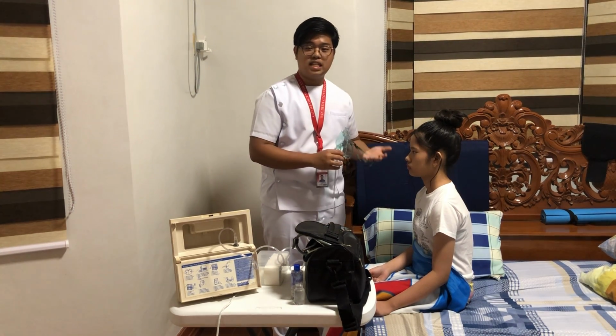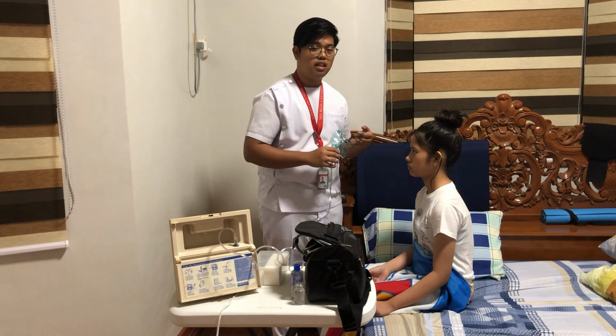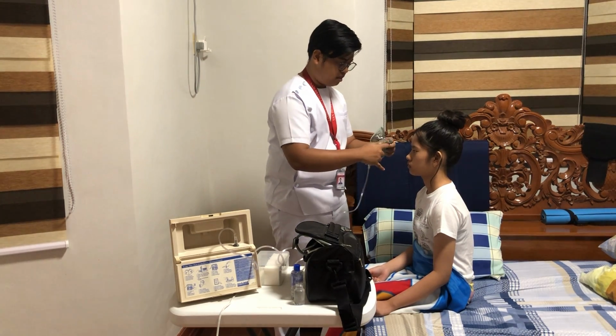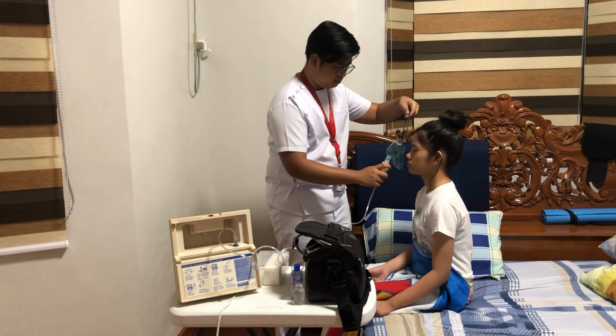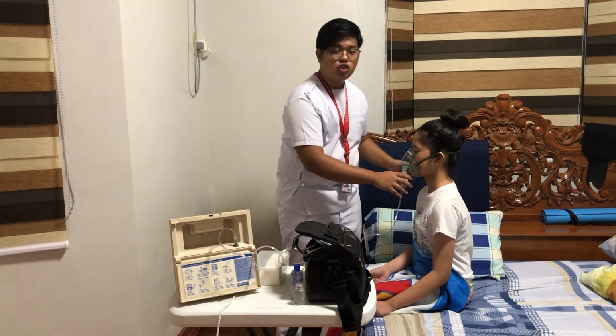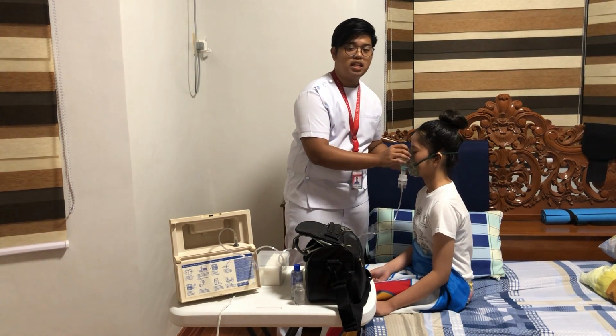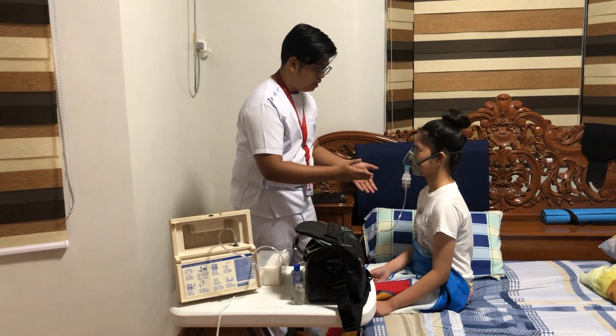So again, we need to assist the patient, but this time we're using the mask. It is a different delivery system. We must make sure that it is well fitted and our patient is comfortable with the fitting of the mask. Ma'am, are you comfortable with the mask po?